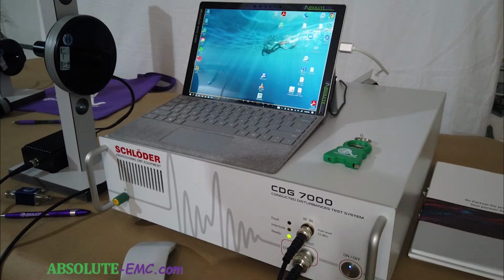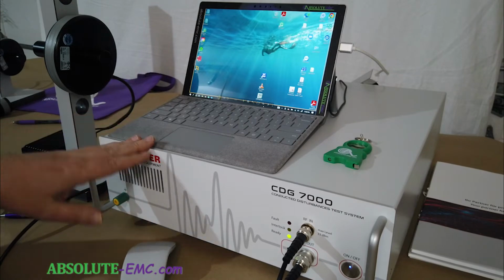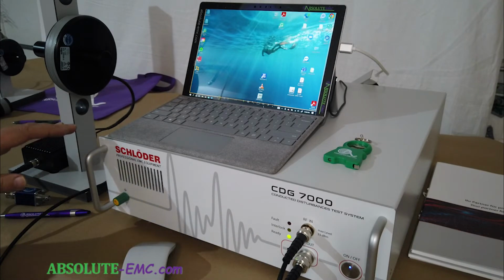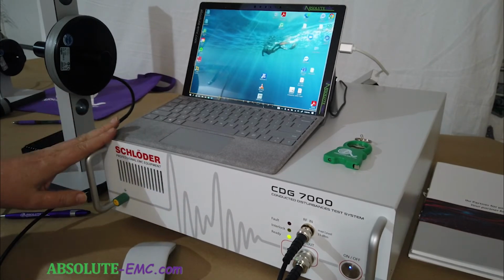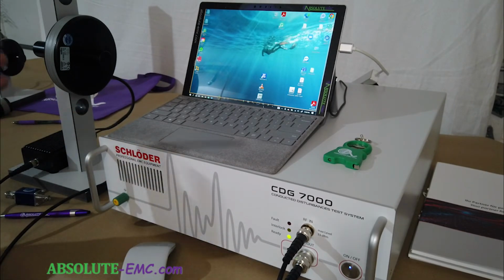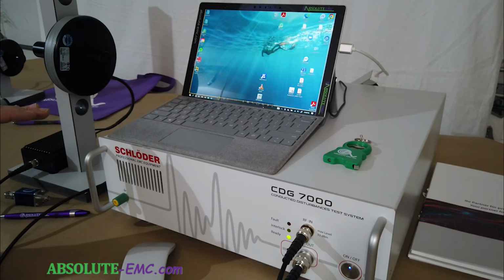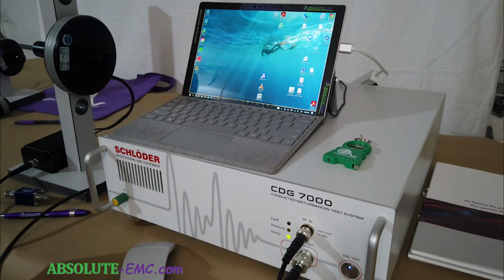You connect the computer to the generator with USB or Ethernet. USB is a very simple setup. It really auto discovers the generator pretty easily. With Ethernet, there could be some more setup to align the IP addresses. So what I would suggest is to get everything working on USB first, and if you want to use Ethernet, once you have everything established and working, then work on setting up the Ethernet, and we can help you out with getting that set up. There is a USB dongle that allows the Helia software to work, so make sure that is connected to your computer as well.